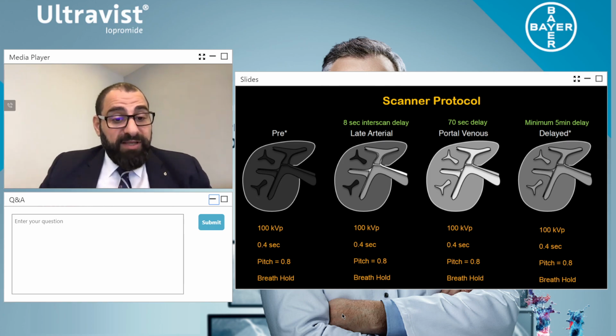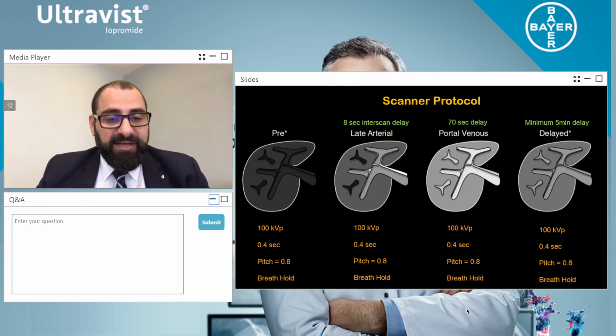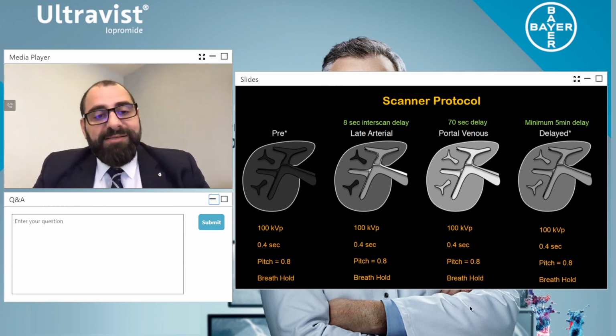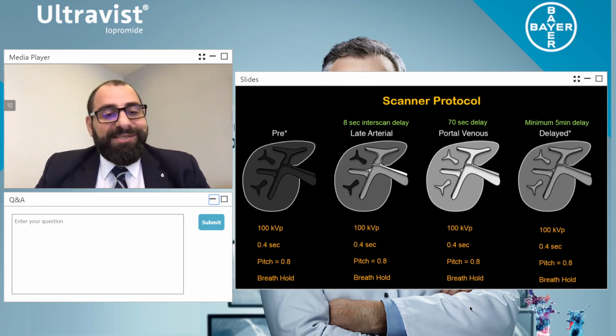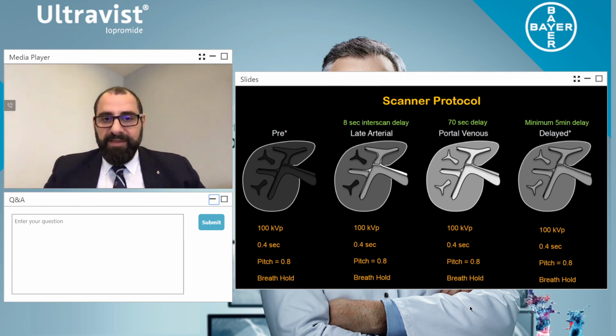Now, would the contrast injection protocol be the same for 16 slice, for Abhishek Gorlawar? Excellent question. So we said that 3.5 mils a second for 16 slice to 64 slice is perfect, and the rotation time at 0.8 seconds. Look, if 0.8 seconds is the fastest you have, depending on which scanner you have, you have no other choice. But if you can get it lower, that's even better.